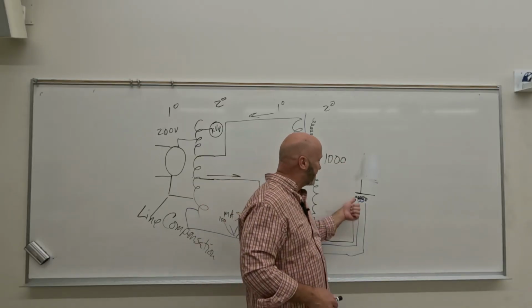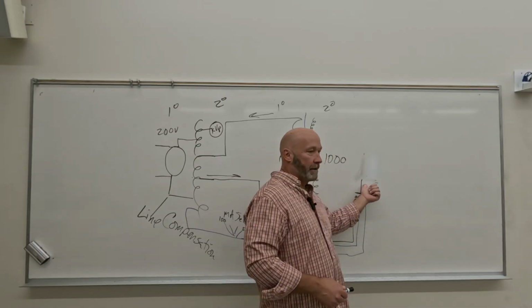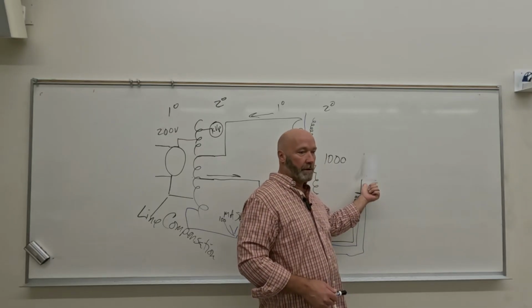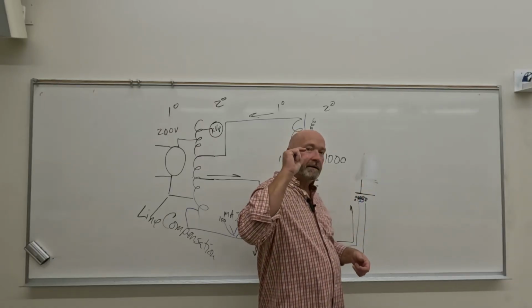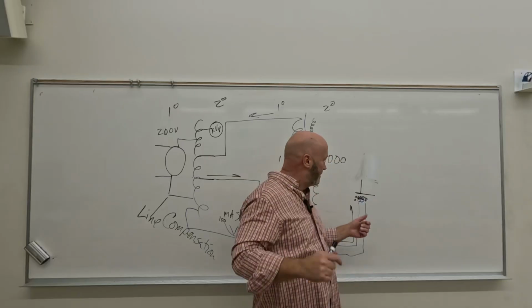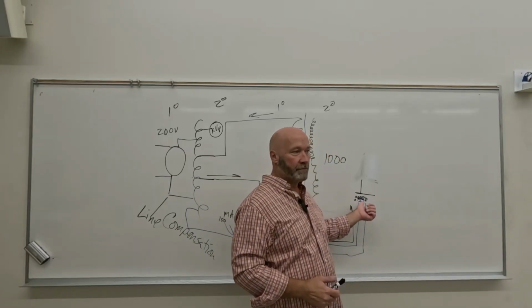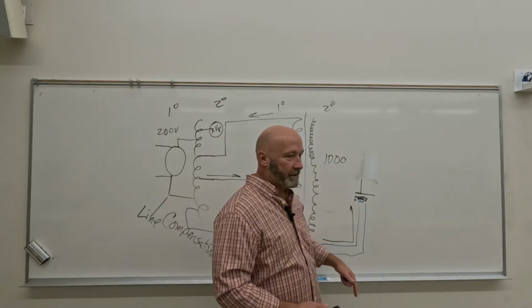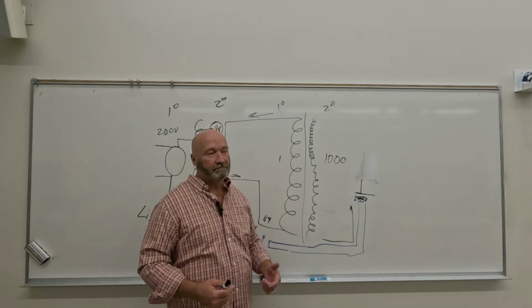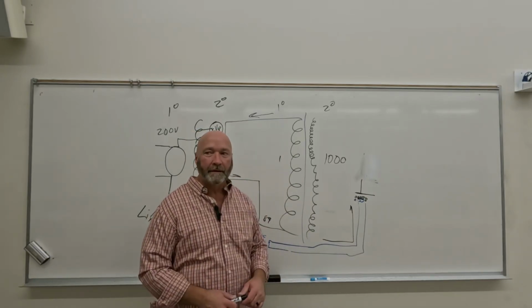So what we're going to have to do is get rid of the alternating current, because if we send electrons back across the tube and they're hot, they can damage the rotor. Well, how thick is the rotor? It's a chunk of metal, right? So if it can damage that, what's it going to do to a light bulb filament? Destroy it, right? The likelihood of sending electrons back across the tube that way is not very good. So that's probably overstated a little bit.